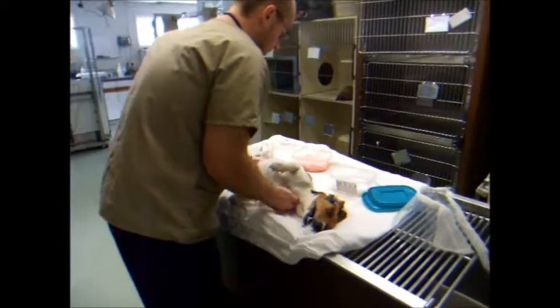Now I'm going to take her over to the surgery table. Make sure not to touch that area.